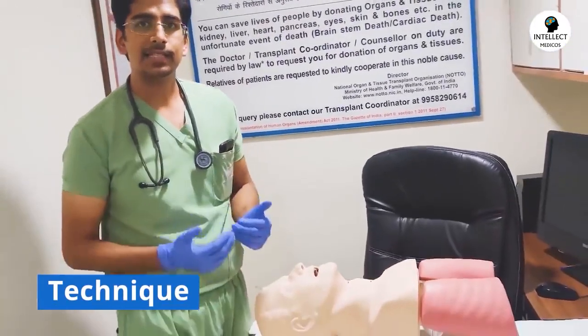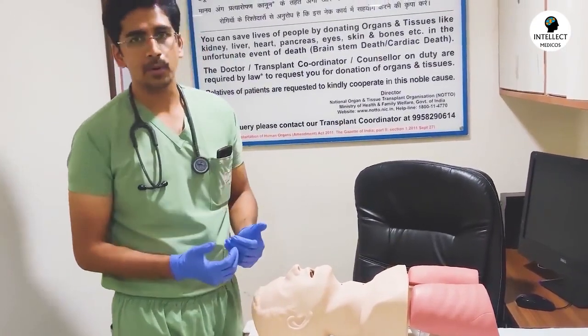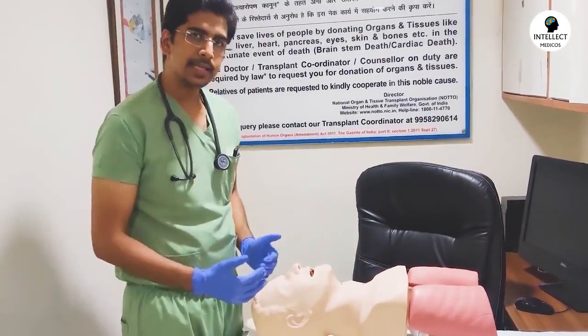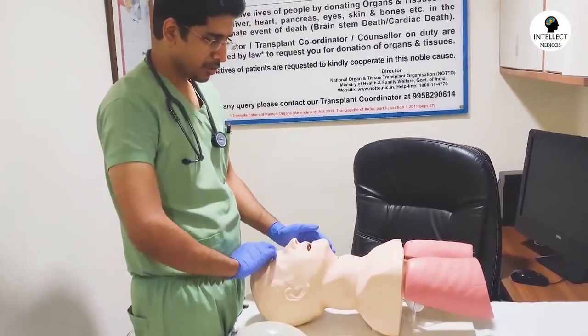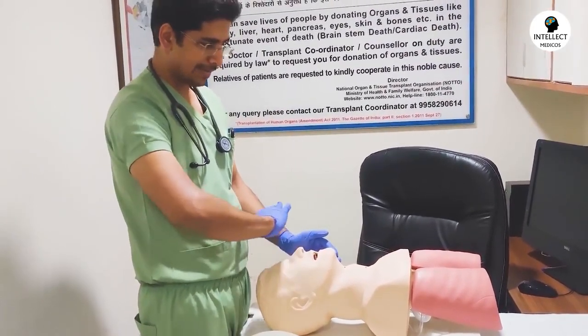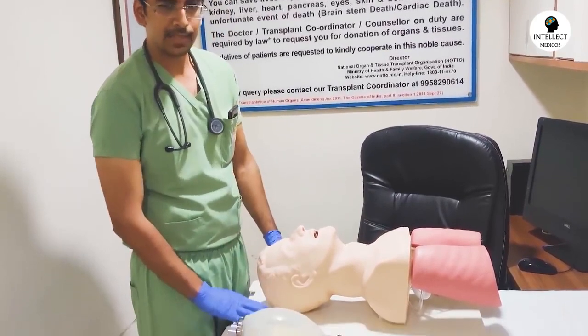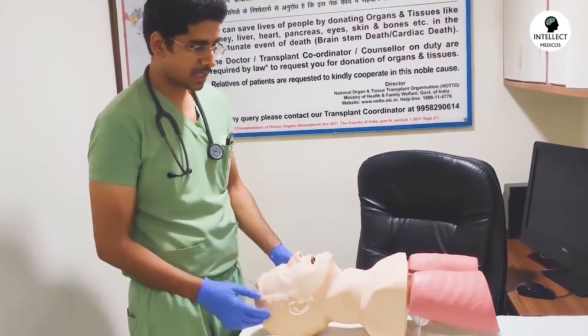First and foremost, when you are intubating a patient, the position of the patient as well as the position of the rescuer who is going to intubate is very important. The patient should be as near as possible to the rescuer, and the head of the patient should ideally be approximately equal to the umbilicus at this level. Although I don't have that bed over here, so I'll just demonstrate with this position, right?